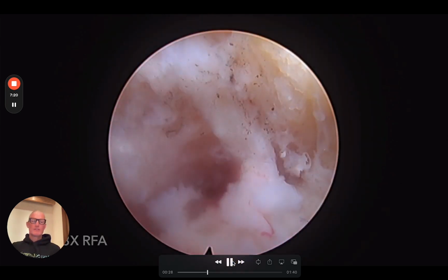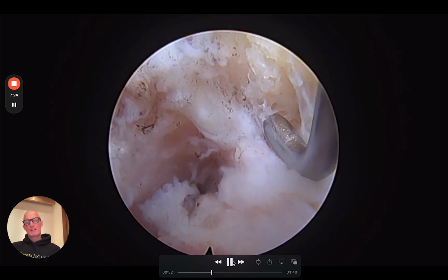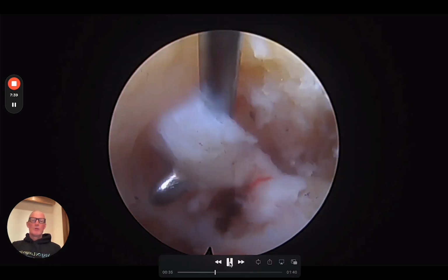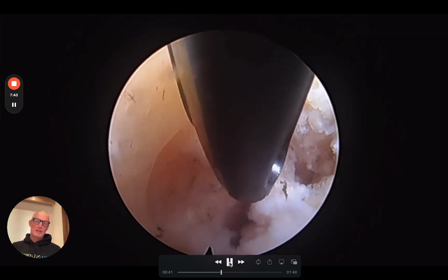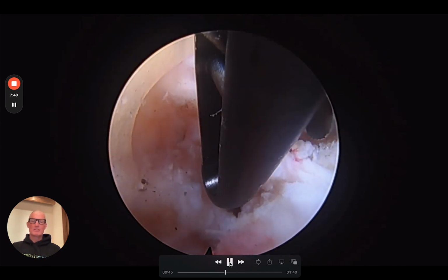The nerve is still visible. Most of the perineural fat has been removed. This area is now relatively immobile. The nerve is still scarred down and can be manipulated with a nerve hook, but you can see that the surrounding area around the nerve is relatively avascular. Most of the fat has been melted away by the previous application of heat. And here we're mobilizing the nerve. Here, this is a very interesting finding that I see frequently after previous percutaneous radiofrequency ablation: the mammillo-accessory ligament is actually calcified.